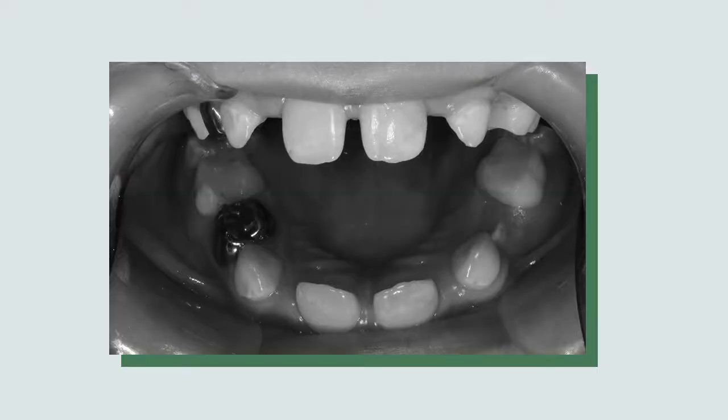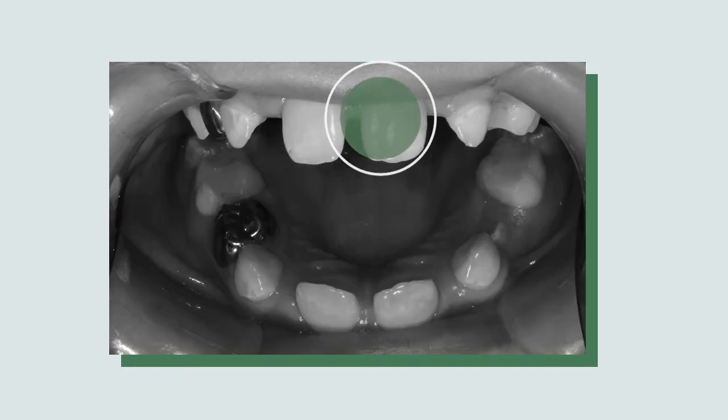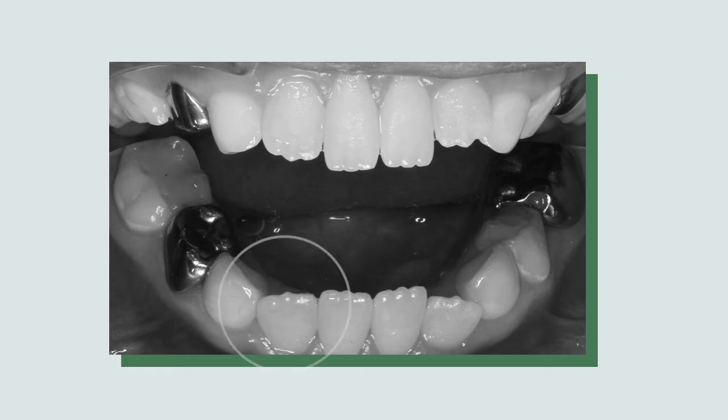We're often asked why we take our three-dimensional x-ray before we start braces. So I want to explain some of the reasons why. I've got a patient here that has some spacing in between her teeth, does not have a lot of room for her lateral incisors, and I can just tell her the width of her upper jaw, and this is the upper jaw shot into a mirror, is narrow compared to her lower jaw shot into the mirror right here.